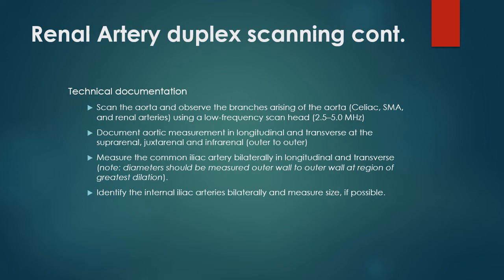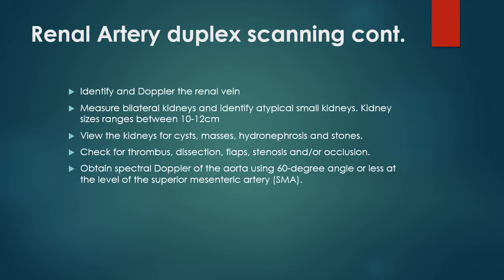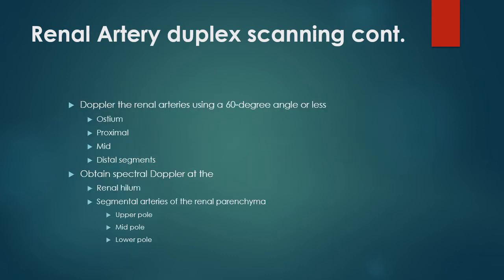When imaging the renal artery, first take a look at the aorta and rule out any abnormalities within it. Then image your renal artery. Identify and doppler the renal vein. Measure bilateral kidneys and identify atypically small kidneys — kidney sizes range between 10 to 12 centimeters. View the kidneys for cysts, masses, hydronephrosis, and stones. Check for thrombus, dissection flaps, stenosis, or occlusion within the renal vein. Obtain spectral doppler of the aorta using a 60-degree angle or less at the level of the SMA, then doppler the renal arteries from the ostium through the proximal, mid, and distal segments.